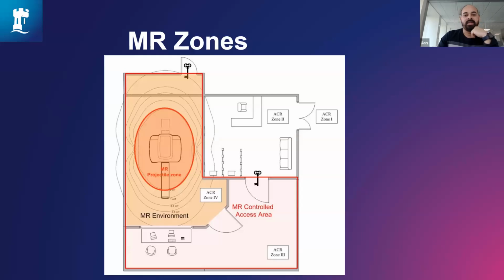Now, this is a typical MR department. And the MR department is usually divided into 4 zones for safety reasons. Zone 1 is outside the MRI department, where the general public or anyone could be around. Zone 2, as depicted here, is where you usually have the receptionists and the staff who help with patient entry and details coming in.